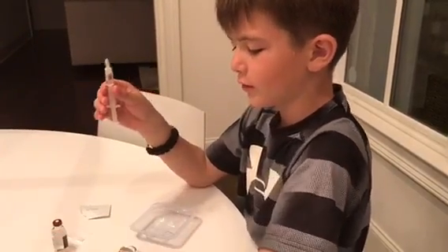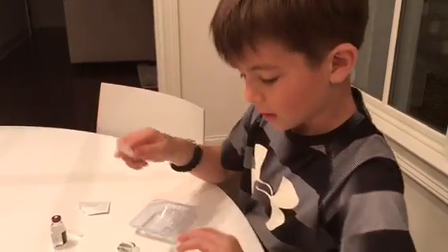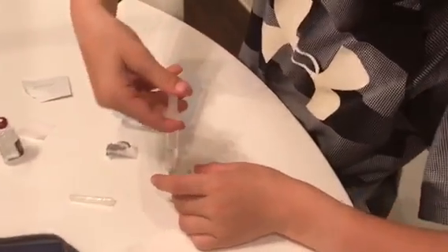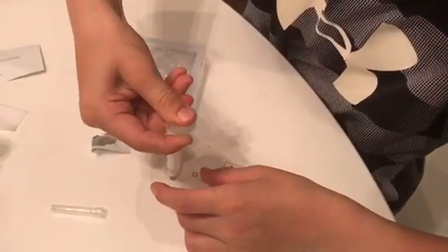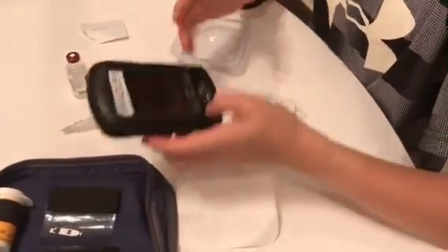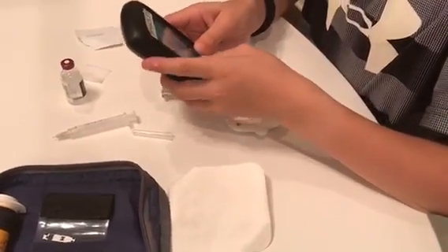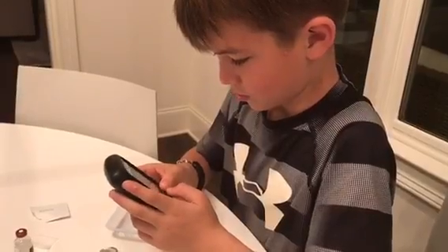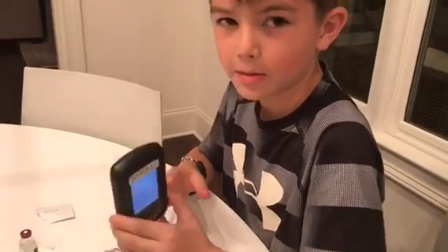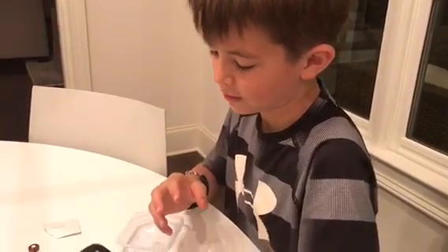After I think I have enough air bubbles out, I will press it into this hole and squeeze it in. Squeeze good. After you hear the two beeps, you can say yes. Now it's priming. It will take a minute or two for it to finish.